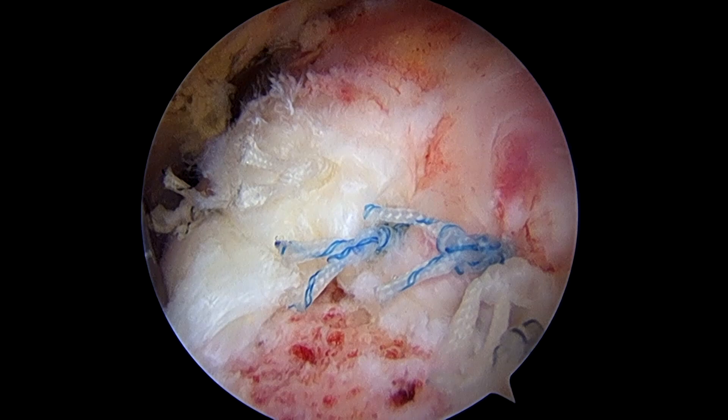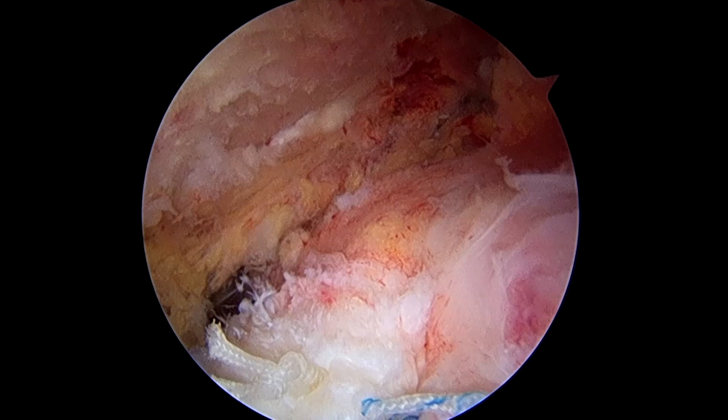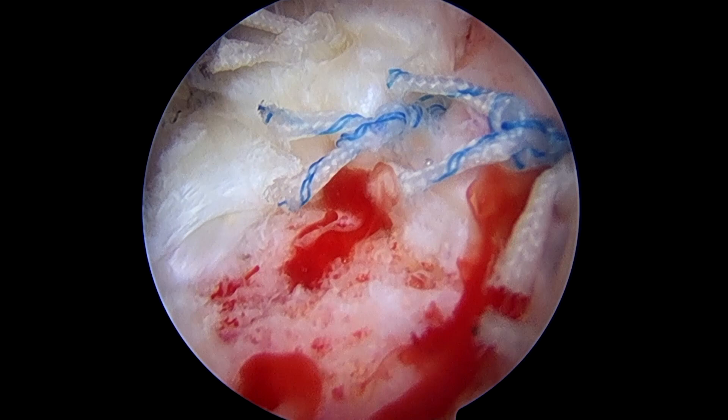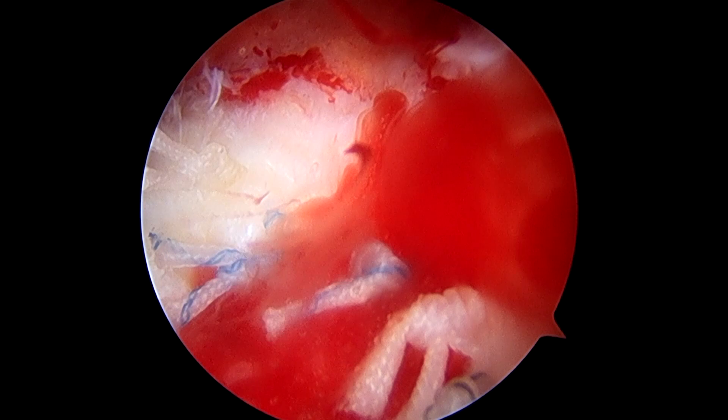Here's a view of the completed rotator cuff repair. You'll notice the bone marrow vents in the tuberosity and the sutures holding the tendon in a non-tensioned position. Rotating the scope, we can see the completed subacromial decompression above. By turning off the water flow, we can watch the bone marrow as it issues from the bone marrow vents and tracks medially to form a large, velvety red clot over the area of the rotator cuff repair. This is the so-called bone marrow crimson duvet.